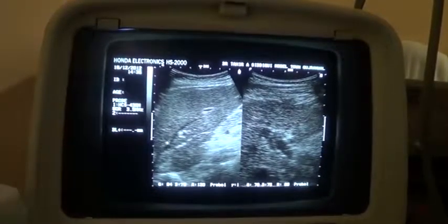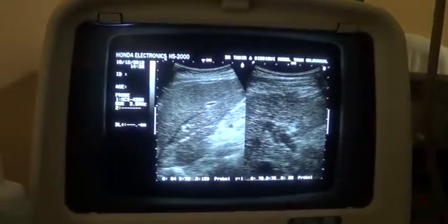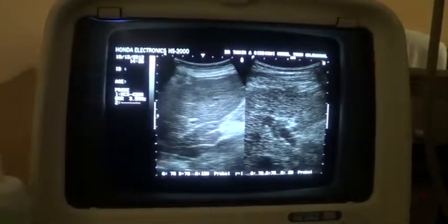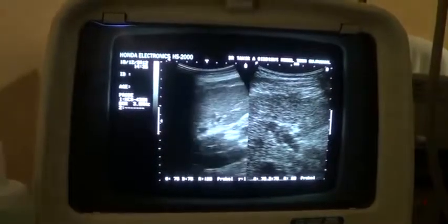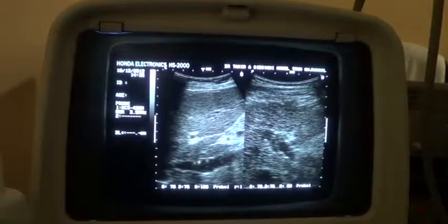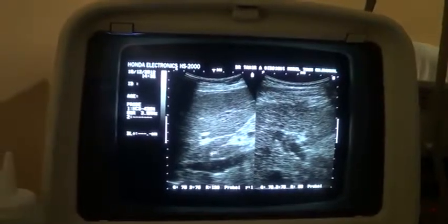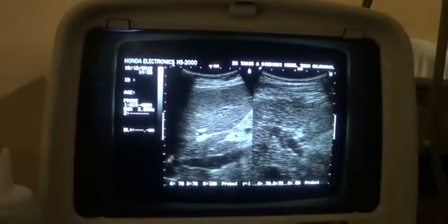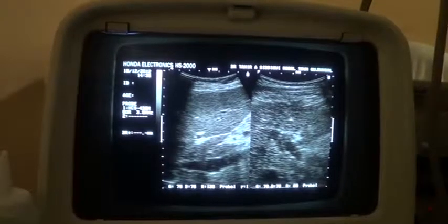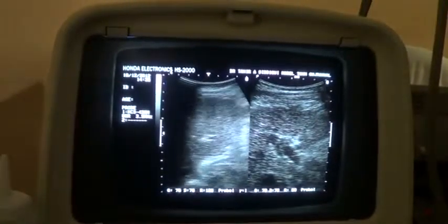This is the hepatic vein — note the degree of blurriness of its margins. Again you see the irregularity of the outer surface. Now another thing is that in this case we see something opposite: the caudate lobe has the ligamentum venosum, the echogenicity of the caudate lobe is preserved, and you can see a tiny tubular structure which is the vessel within the caudate lobe. Note the degree of echogenicity and echotexture of this liver versus that liver. So this is a more advanced stage of cirrhosis, and this is a case of early cirrhotic liver parenchymal changes.